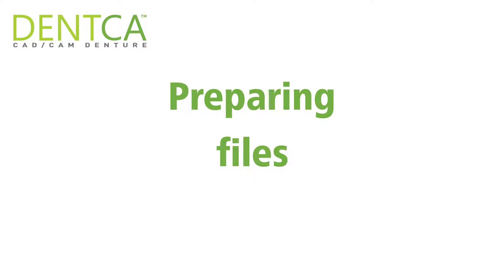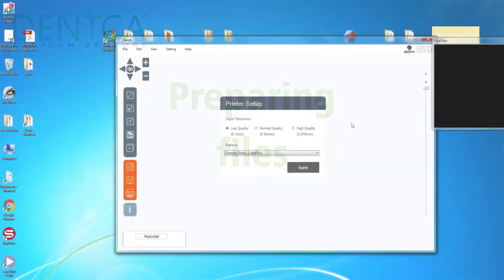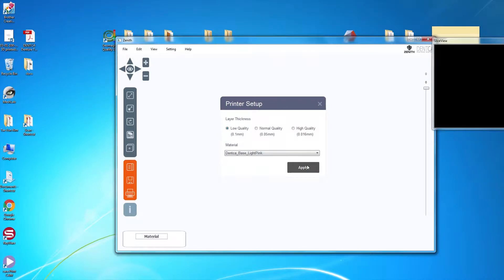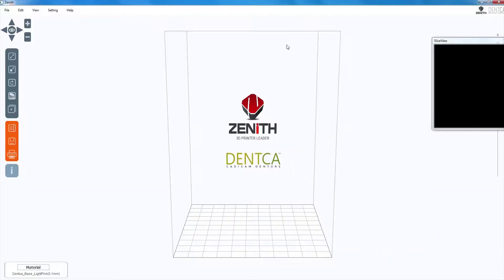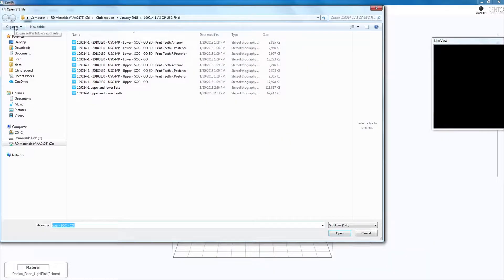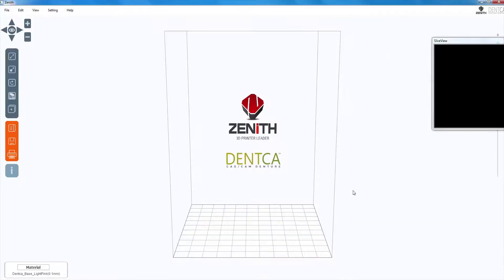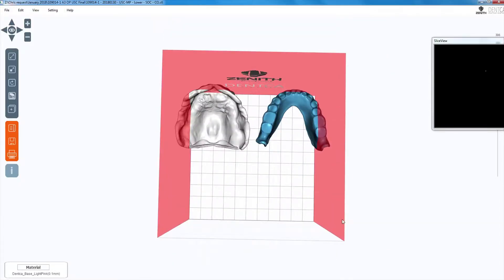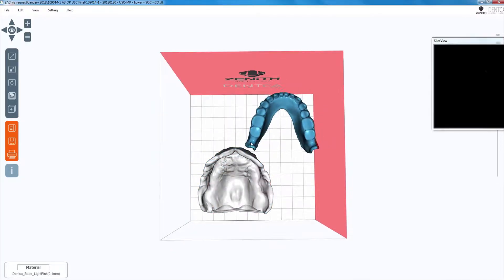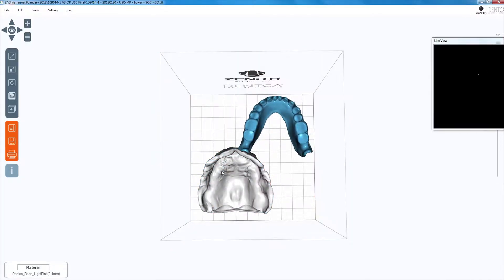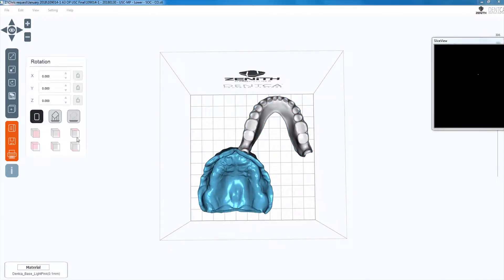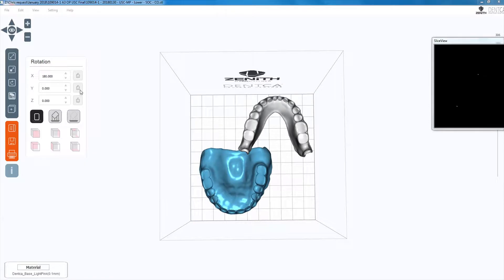Preparing the files. Once Dentca has designed your case, they will send the design files back to you. Download the files into the computer you'll be doing printing on and open up the Dentca Zenith software. Open up the files by clicking on open and then select the desired files. It is important to ensure that they fit within the square. You can move the denture bases around to ensure they fit within the building plate.